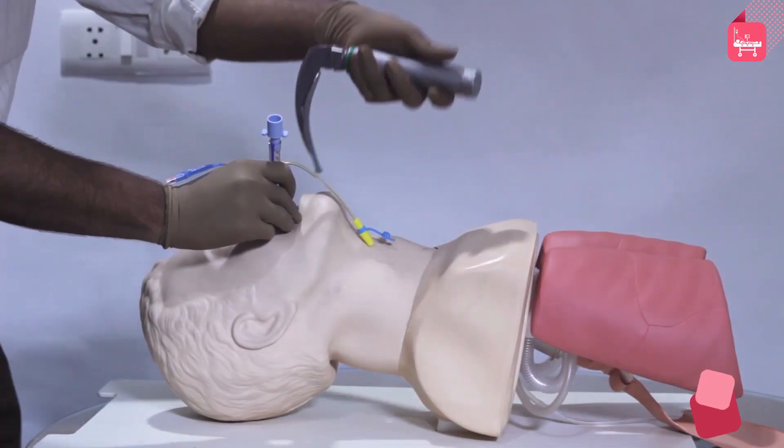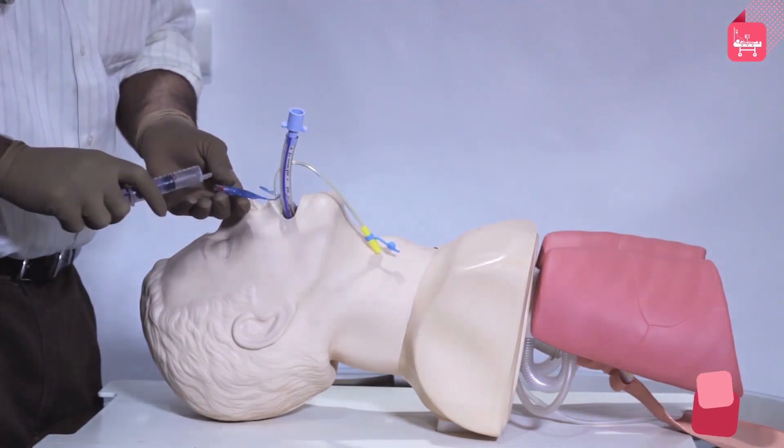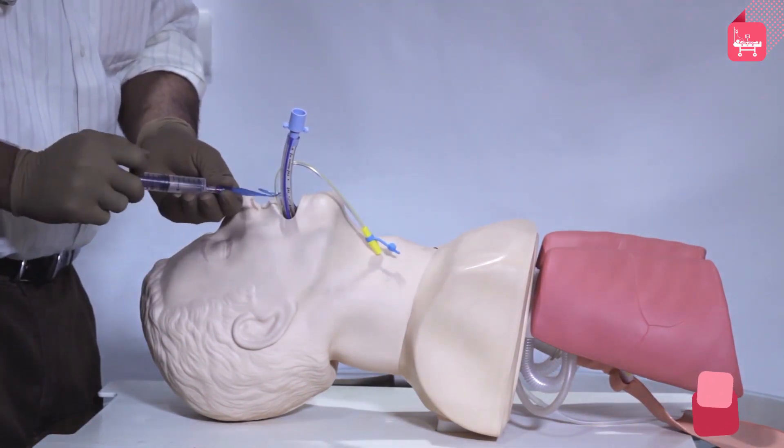The laryngoscope is gently withdrawn, taking care not to injure the lips and teeth. Inflate the cuff with 5 to 10 milliliters of air using a syringe.